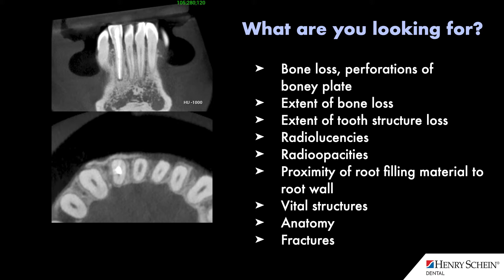We also want to look at the anatomy itself. Whenever we're evaluating the root canal treatment, we want to see if it respects the anatomy — meaning if it's centered within the tooth all the way down the root. We want to see if it's an adequate length and size, or if it's excessive at any point, and if there is a very thin root remaining at any point. If there is a very thin root wall left after root canal treatment, sometimes that may affect the prognosis of the tooth.